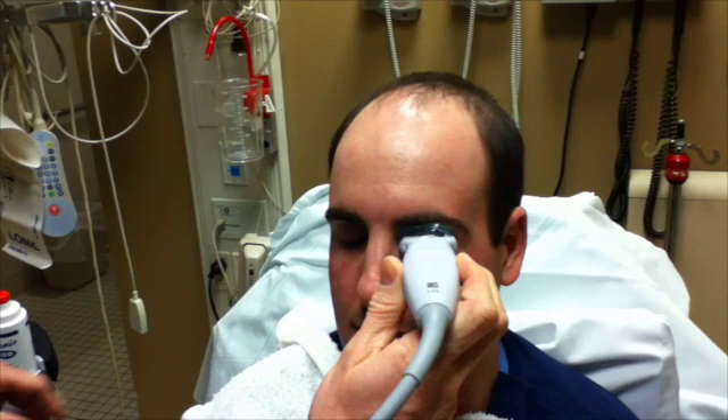Retinal detachment, vitreous hemorrhage, and other orbit pathology can be difficult to diagnose with traditional physical exam. Ultrasound can help make the diagnosis much easier.